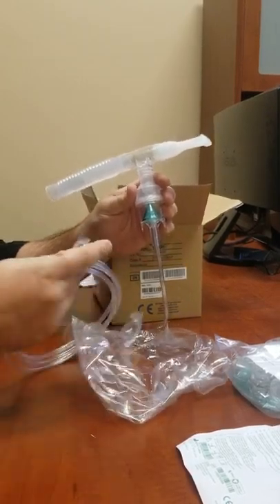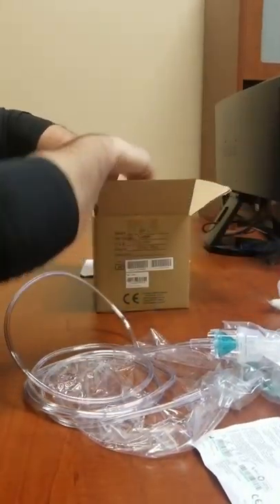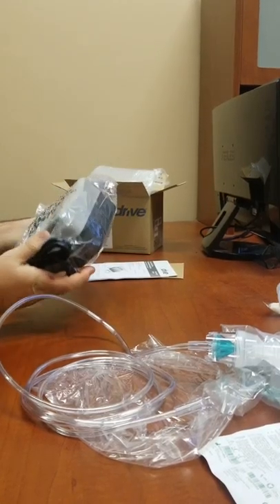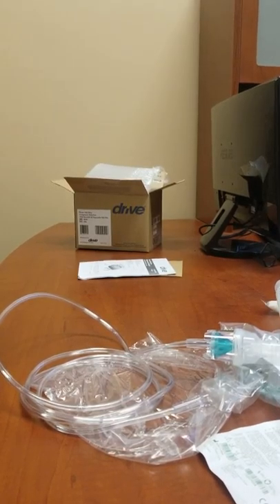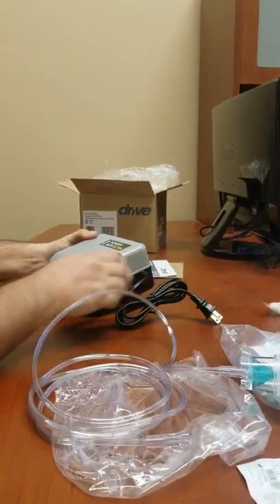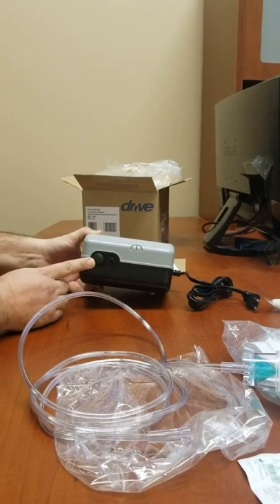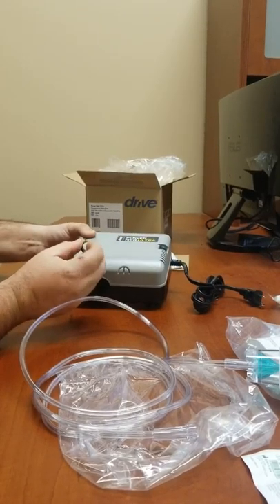Twist it on, and then on your machine, this will plug into your machine. So we'll get your machine out and pull the machine out of the plastic. Plug it in to an outlet. You have your on and off button which will be right on top. Your filter spot is where you can check it every couple months to see how dirty it looks inside.